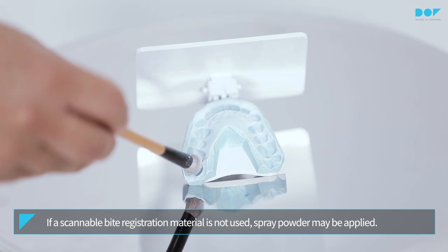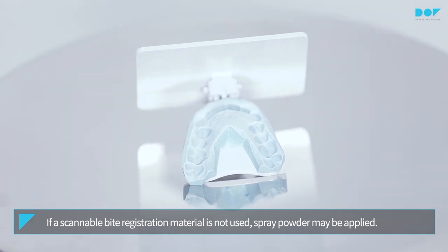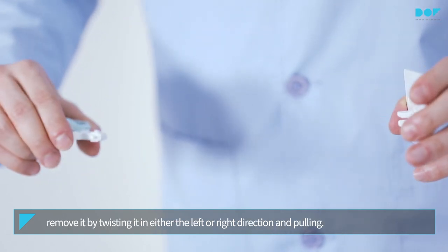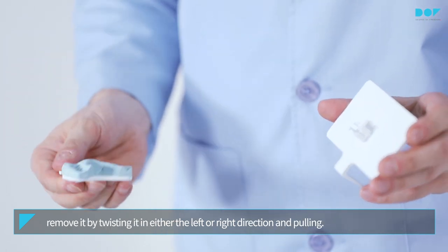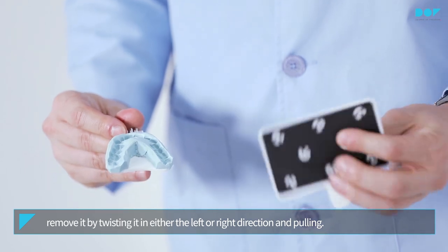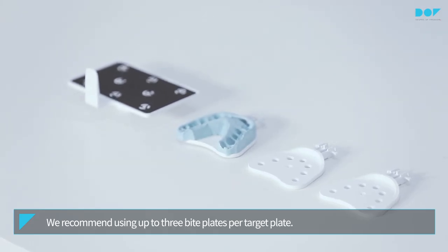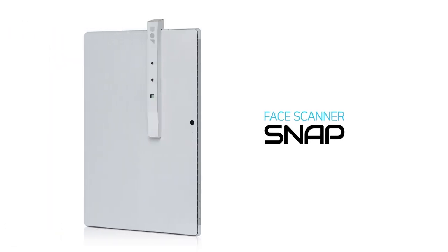It is recommended to use a scannable bite registration material. If a scannable bite registration material is not used, spray powder may be applied. When removing the bite plate from the target plate, remove it by twisting it in either the left or right direction and pulling. We recommend using up to three bite plates per target plate.